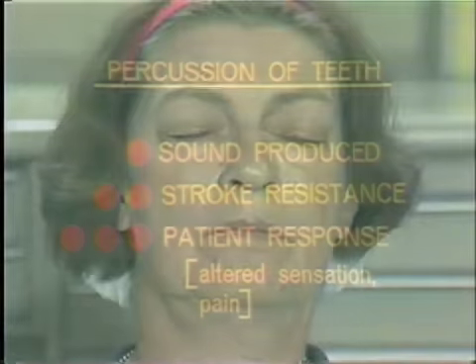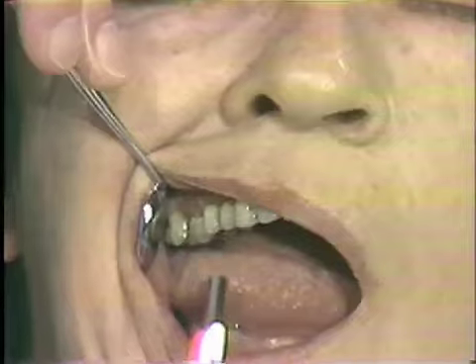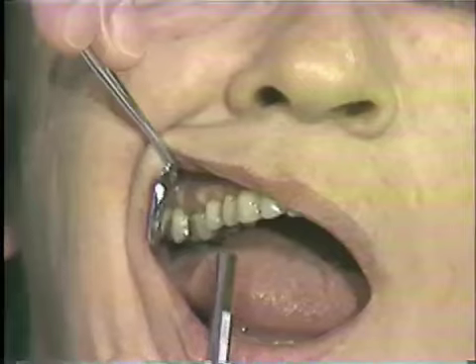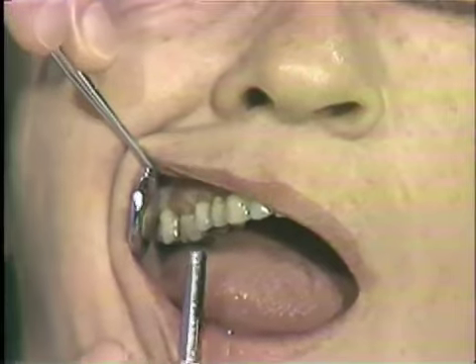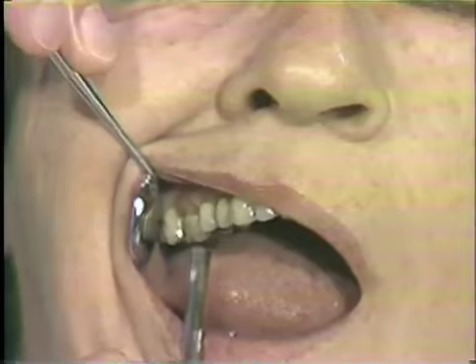Let's go back and see if we can demonstrate some of these situations on our patient. We'll begin percussing on tooth number 3, continuing to number 4. I think there is a detectable difference in the sound that is produced by the percussion process on these two teeth.